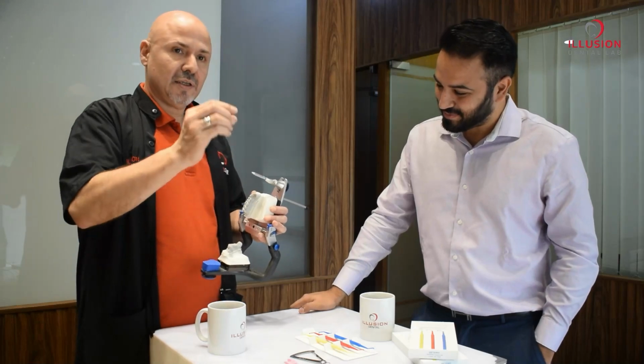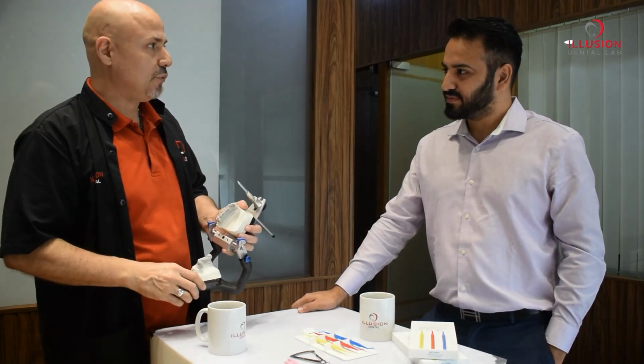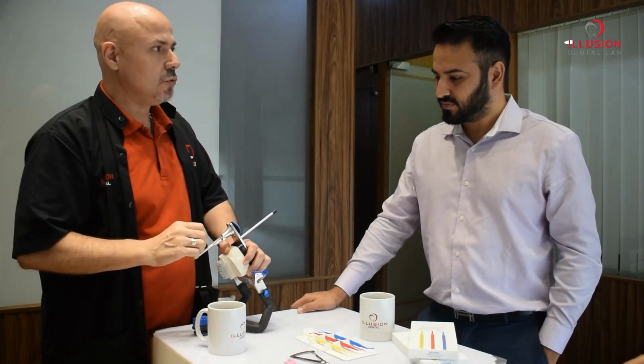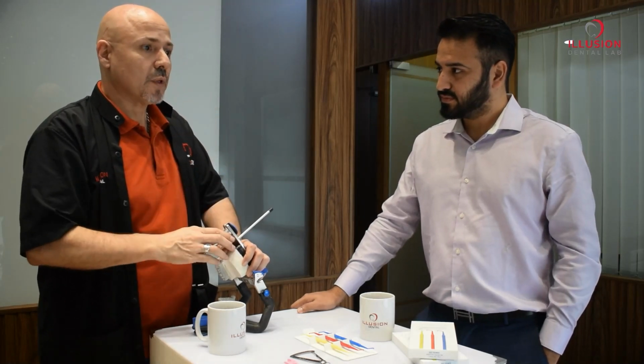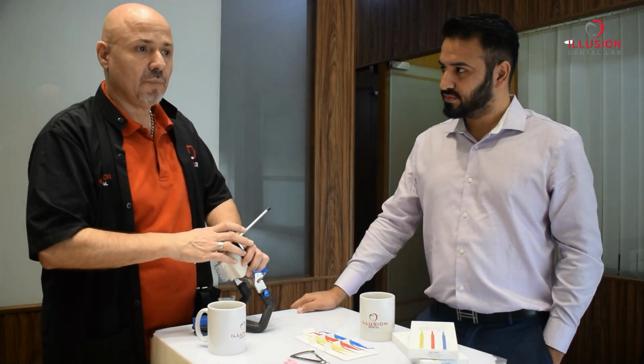So we have basically the virtual spacer of, let's say, 100-150 microns, and then you want a little bit of tolerance to adjust occlusion. Let's plan that also at 100 microns, and if the zirconia should be 0.8 millimeter, then you already end up with 1 millimeter.